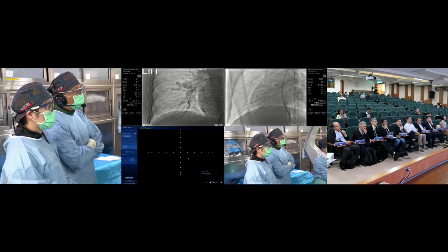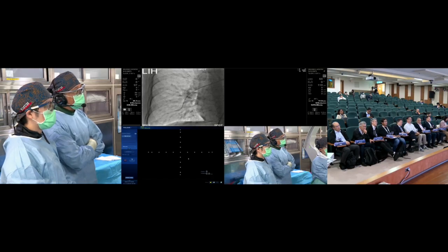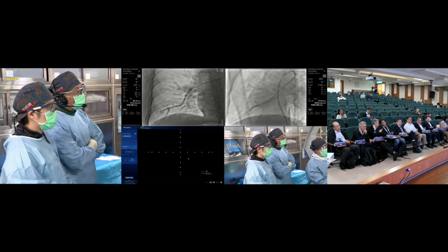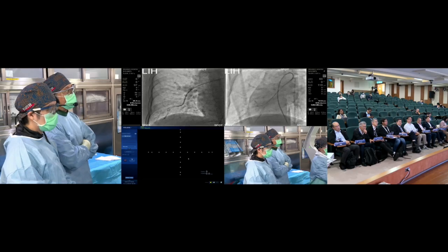For this patient, the mean PA pressure can be up to 55. We will just leave it. Maybe after we treat other lesions, if the mean PA pressure can go down, then in the next few sessions we can try to target this CTO lesion.